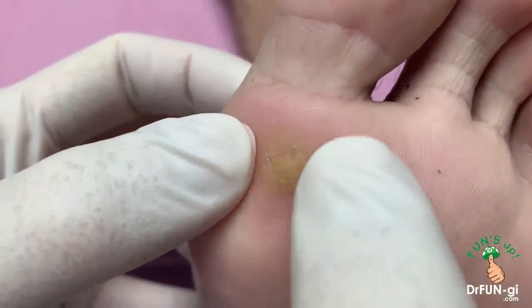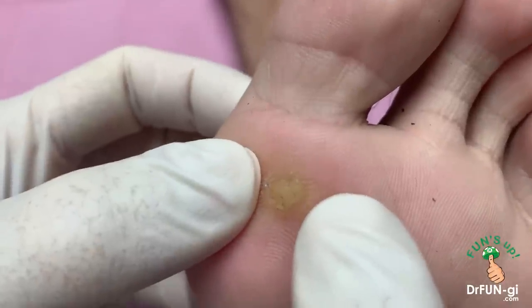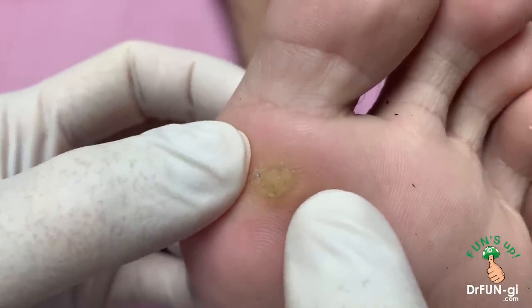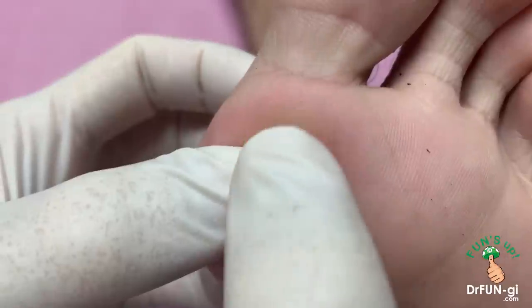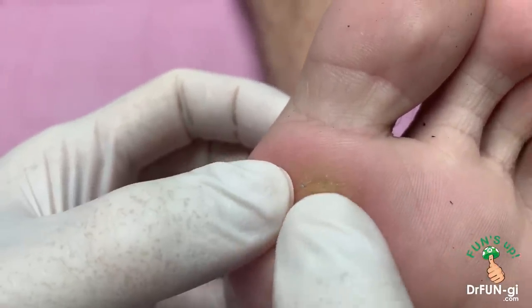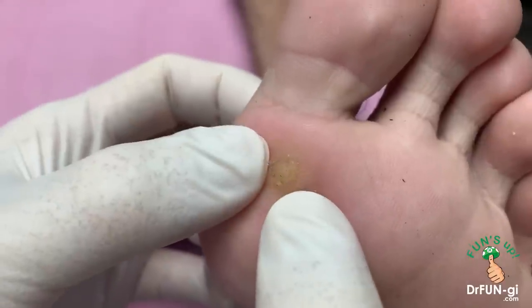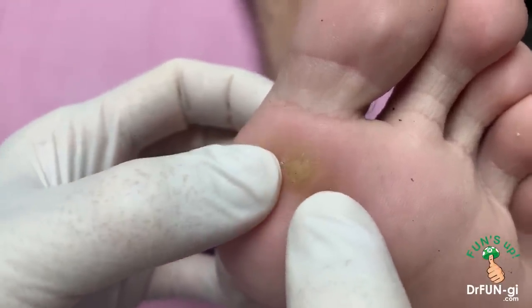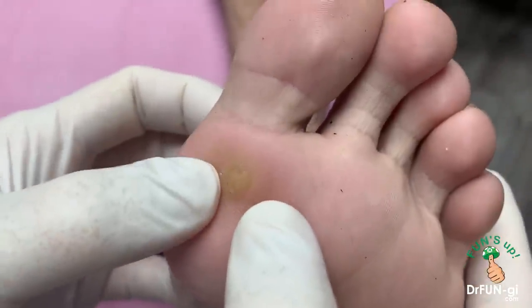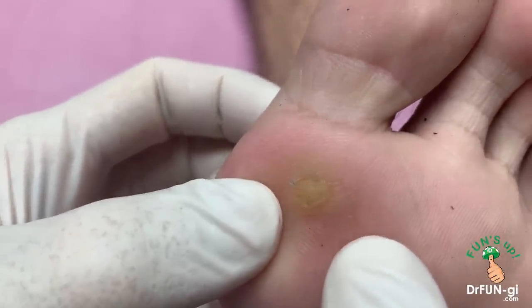I know they surgically remove it or scoop it out, which is fine too, but it's very painful and you have to stay off work because it bleeds a lot. But what we do here is I'm going to do a little laser on it to kill some of the virus, and then we're going to clean this out and then we're going to put some very strong medicine which is very effective. It causes a little blister and then it gets the area better. It may require a few treatments, so we're going to follow the series and show you exactly how this is going to heal over the next few weeks.